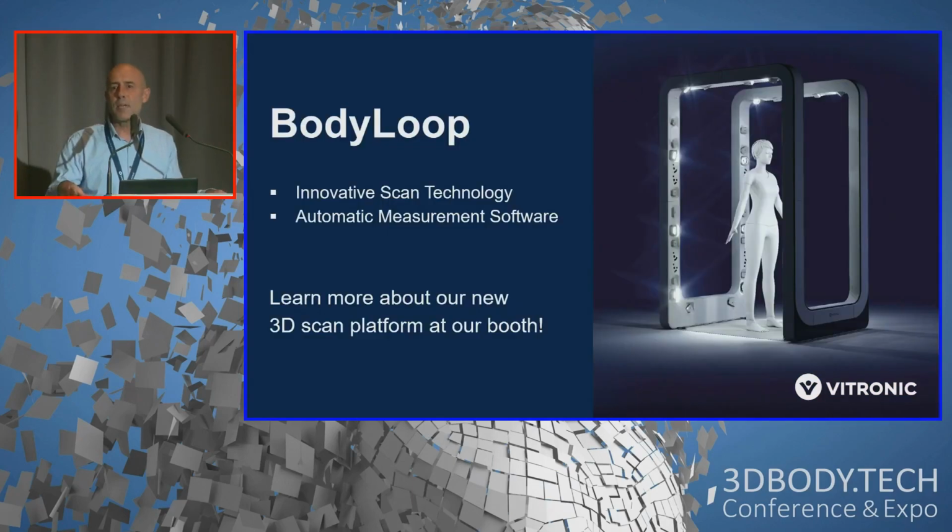An automatic measurement software means, of course, we will generate a default set of measurements, but the user is absolutely free in adding their own anatomical landmarks and own anatomical measurements to the standard set of measurements.